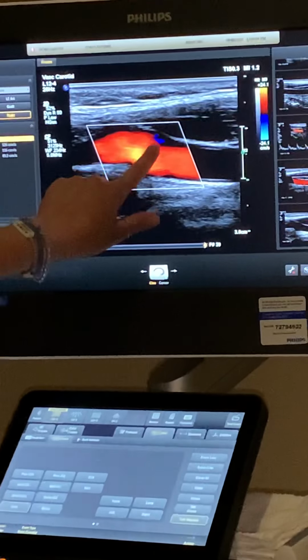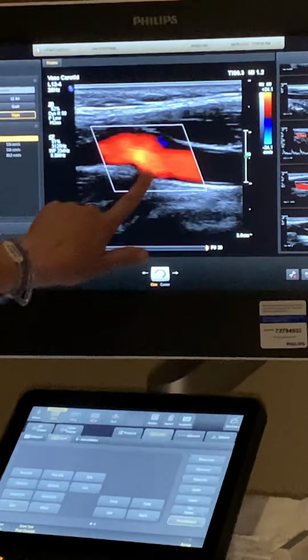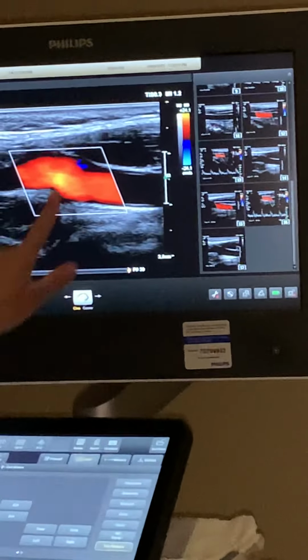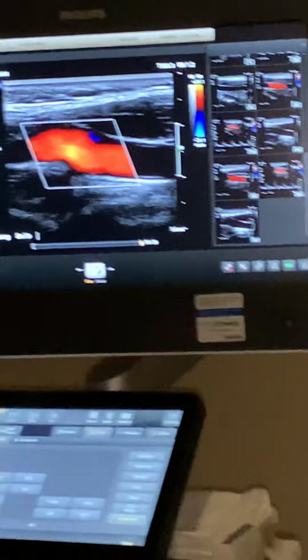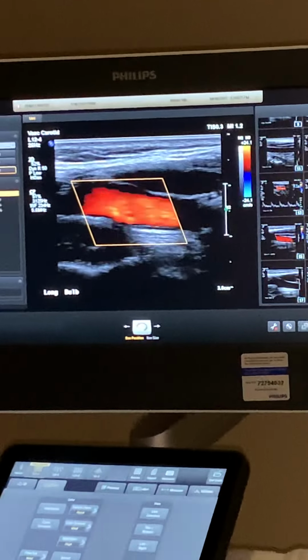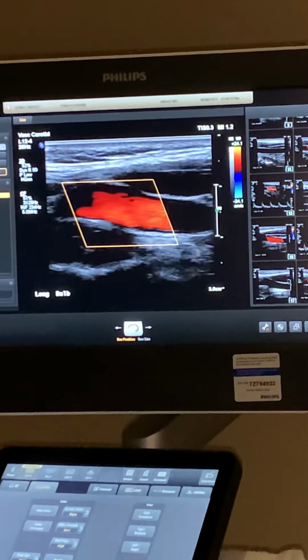So you'll end up with some of this sort of turbulent-like flow. These are considered the eddies here. So that blood is kind of swirling as it's separating into the two different vessels. So it's normal to get that. It's not all red across your screen. In the literature, it's called helical flow. Helical flow, not turbulent flow. You are correct. I think Dara told me that on Tuesday, actually.